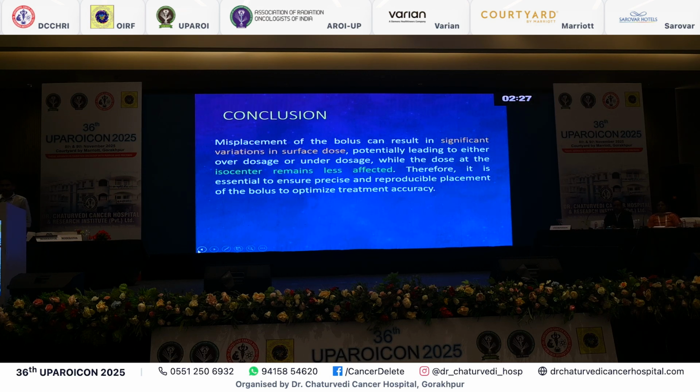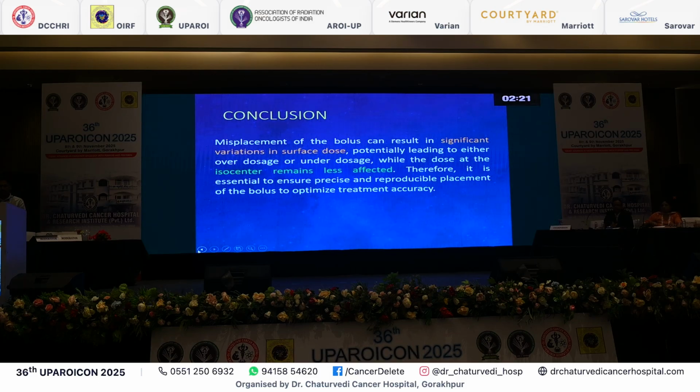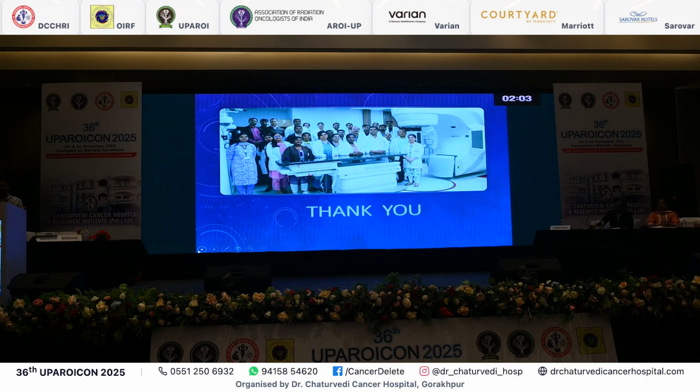The study concludes that misplacement of the bolus can result in significant variation in surface dose, potentially leading to either overdosage or underdosage, while the dose at the isocenter remains less affected. Therefore, it is essential to ensure precise and reproducible placement of the bolus to optimize treatment accuracy. Thank you.